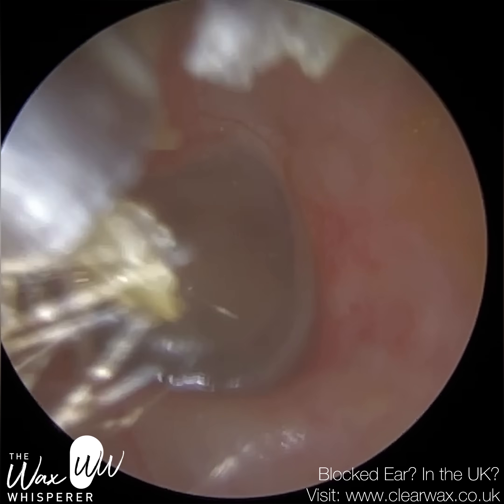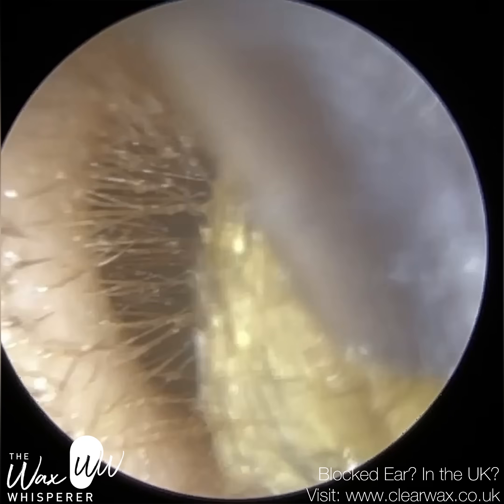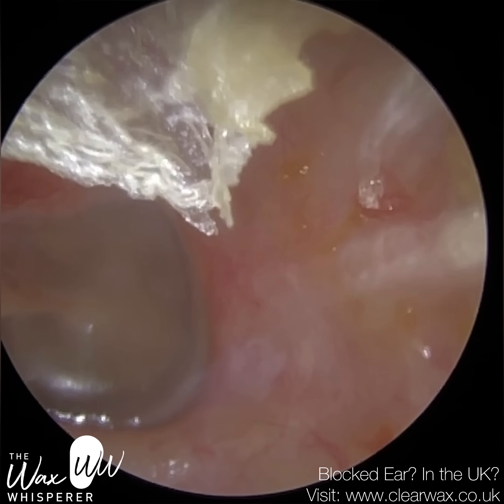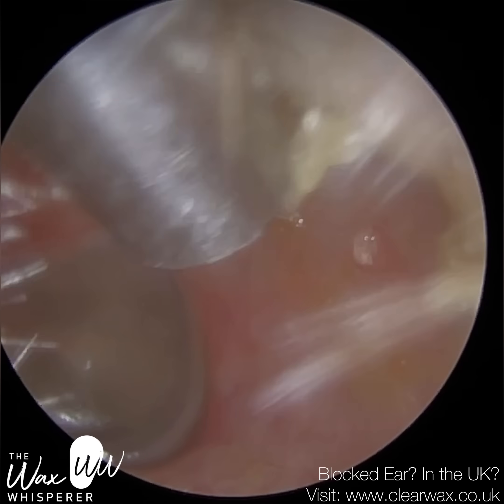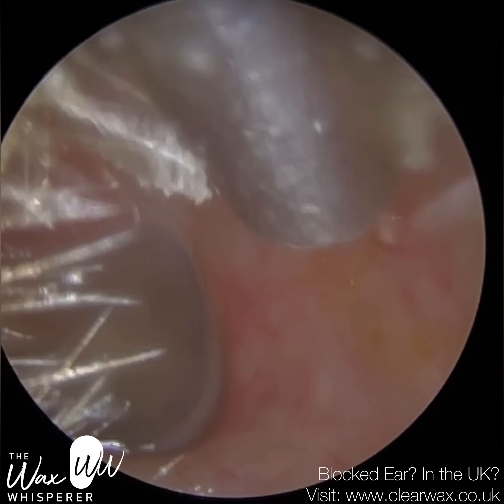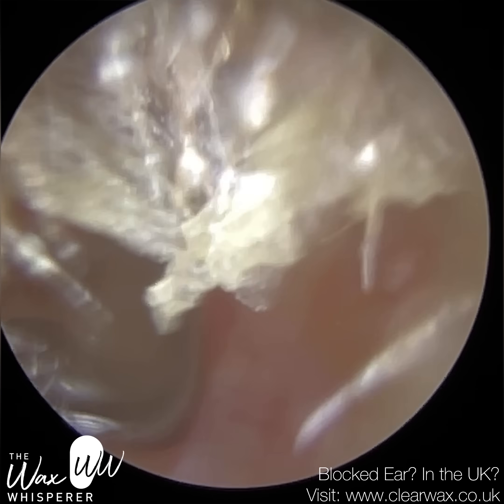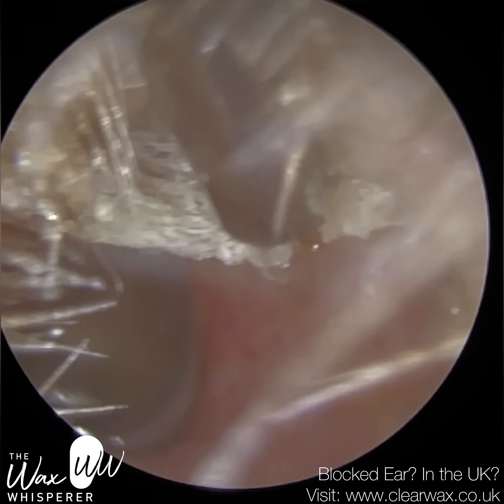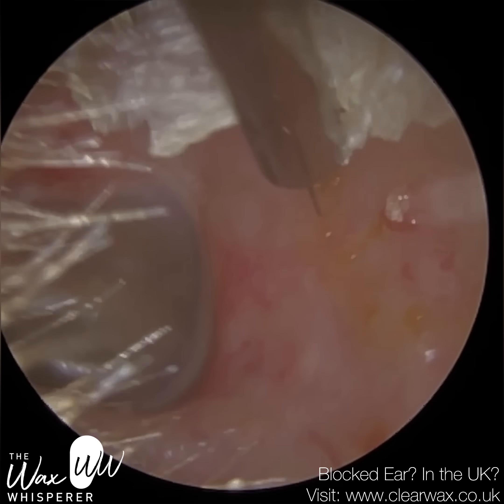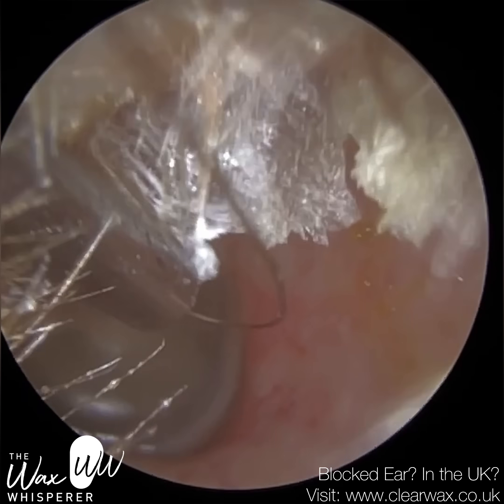Quite often when removing a grade three keratosis obturans, you experience some bleeding because you're also removing granulation tissue which ruptures the blood vessels and capillaries within it — we call it contact bleeding. Grade four is an extremely severe form of keratosis obturans where the dead skin plug has widened the ear canal so far that it merges with the mastoid bone behind the ear canal. We call that an automastoidectomy, and typically these patients need surgery.